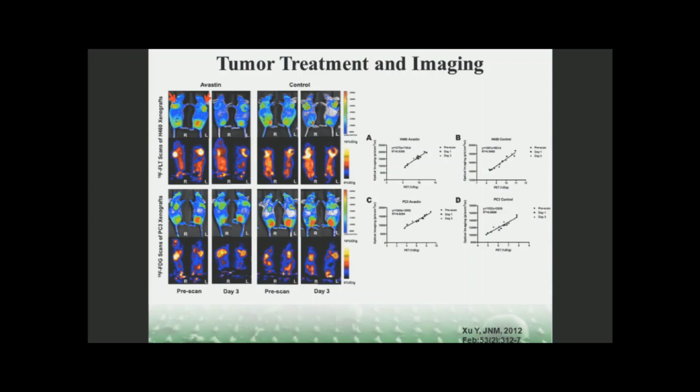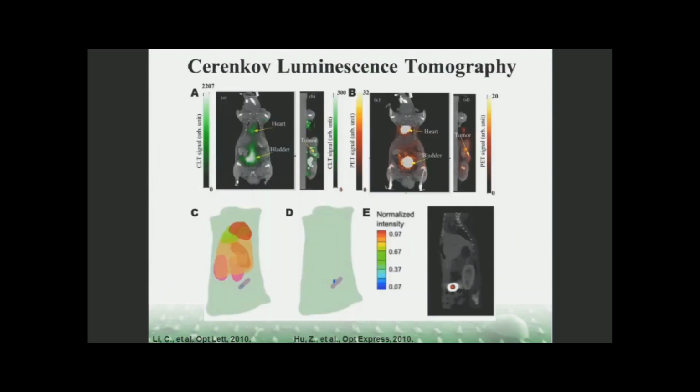I think this is just very good for the drug development industry. So another important application that people are trying to work on is to develop Cerenkov Luminescence tomography.